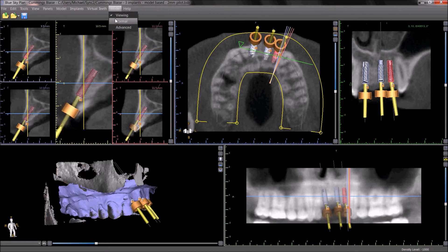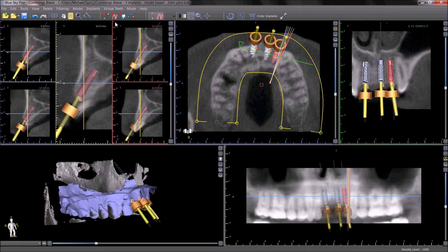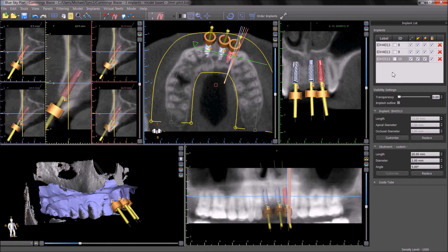The normal mode of the software contains the main functionality of the software. The implant list contains the implant and abutment information. The guide tube information is by default hidden and can be expanded and seen if necessary.